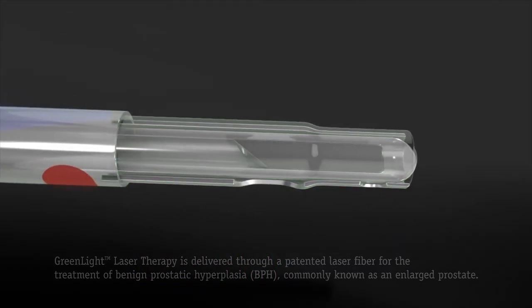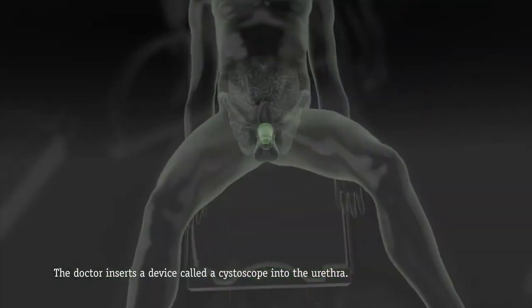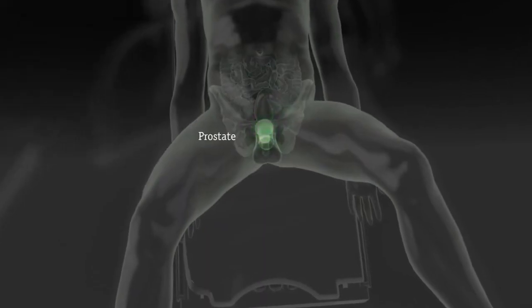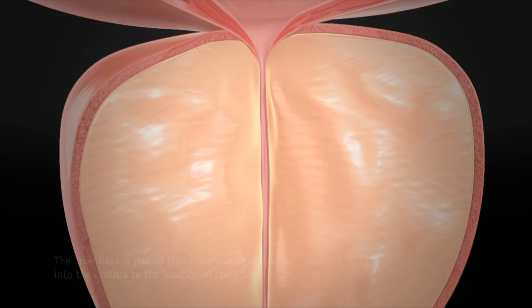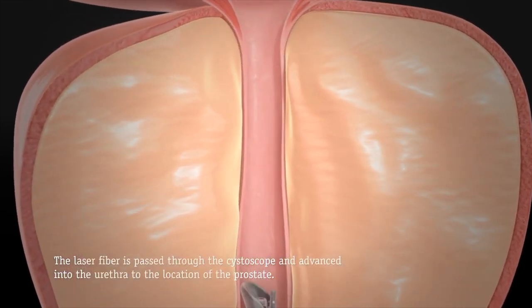This is done through a special laser fiber that we insert through what's called a cystoscope. You can see here the animation showing a surgeon who's about to look into the bladder and the prostate. Once we've done that with our cystoscope, we're able to insert this special laser fiber into the meat of the prostate and use this special wavelength of energy to actually remove tissue.